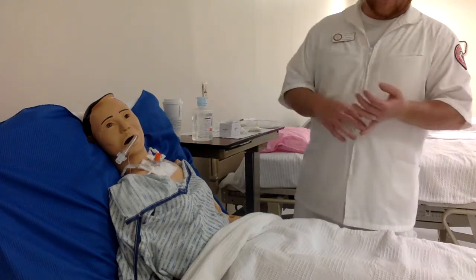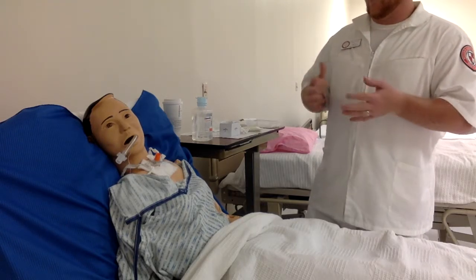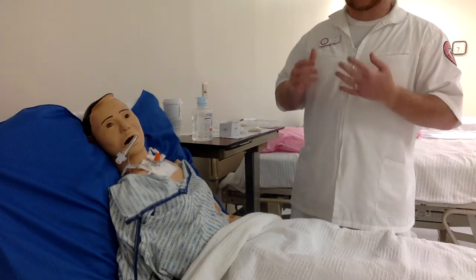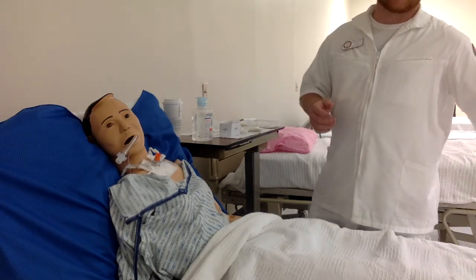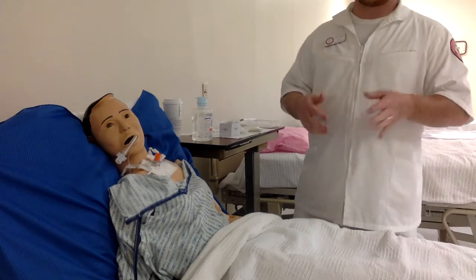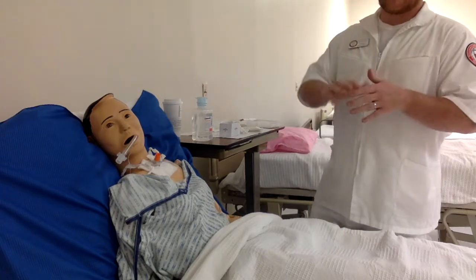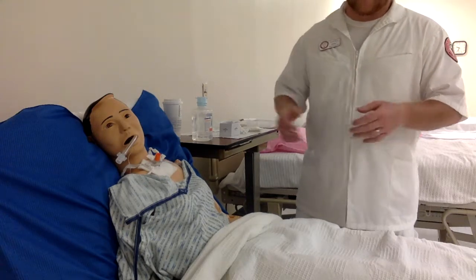You always want to make sure that you document everything you performed, everything you observed, and the patient's response — for example, did the patient try to vomit? Document it all for later reference. It may help the next nurse or physician. For example, the guidelines say 10 to 12 centimeters, but if Mrs. Smith starts gagging at 8 centimeters, document that so the next clinician knows not to go to 12. Documenting the patient's individual norms makes the process easier for everyone.